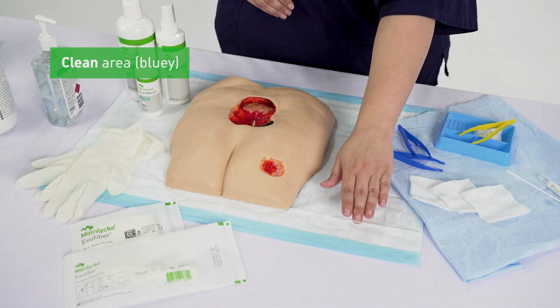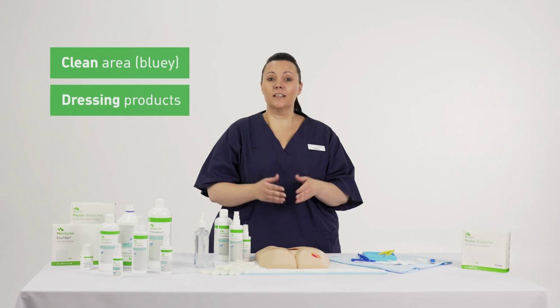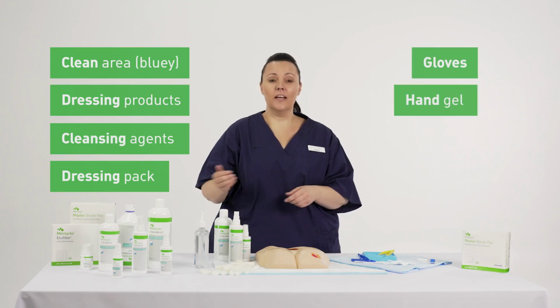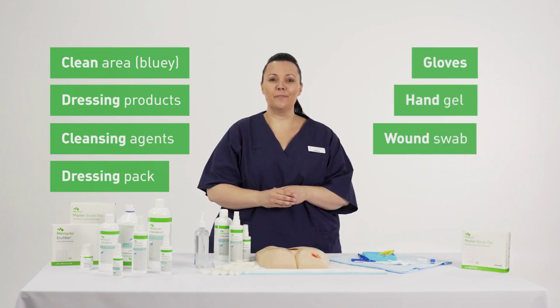To effectively clean this wound, I'm going to need a clean area. In this case, I'm using a bluey. Dressing products, cleansing agents, a dressing pack, gloves, hand gel, and potentially a wound swab. If there are signs of infection, you may want to consider taking a swab. However, we must always think about antimicrobial stewardship. In the same token, think about the best technique for taking the swab. In this case, the gold standard is the Levine technique.